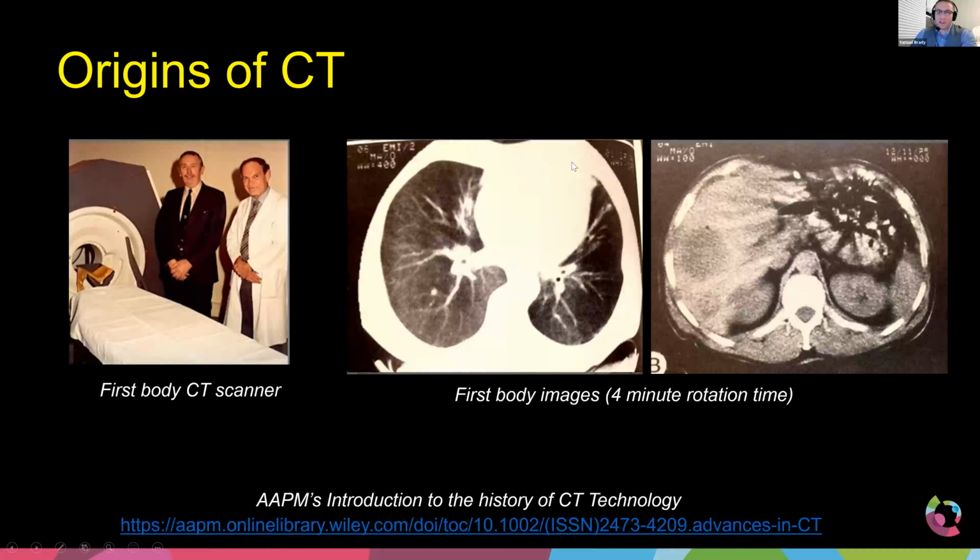And I made this comment last week, and I hope that you appreciate it even here looking at these images. The advancement of technology in CT will do more to change or improve the image quality and the dose reduction ability than really all of the small little knobs that we can twist. And so when you are fundamentally working with a CT scanner that's 10 years old or 15 years old, you're just going to be limited with how much image quality you can improve and how much dose you can reduce. It's fundamental because of the age of the technology.